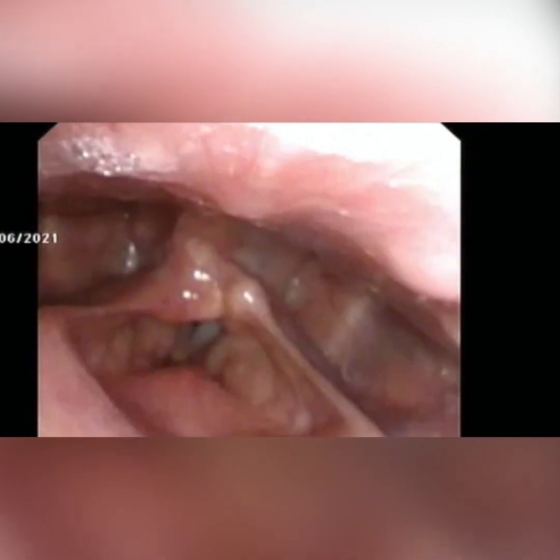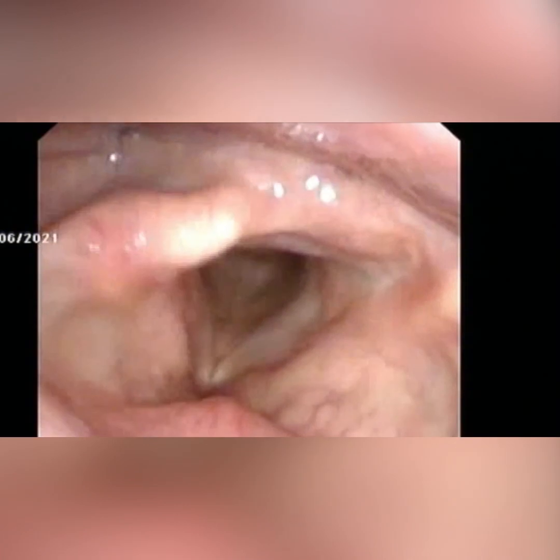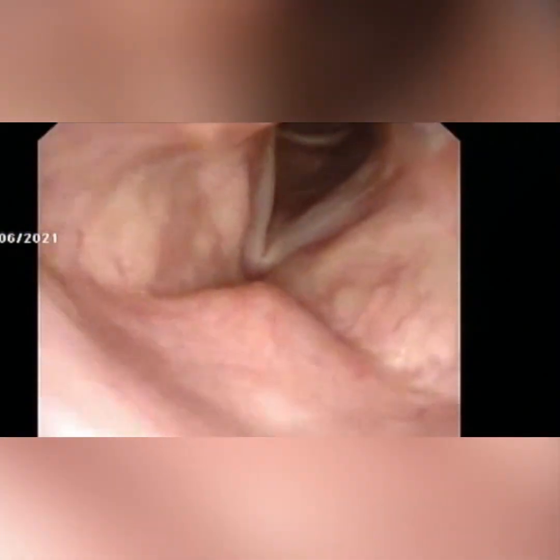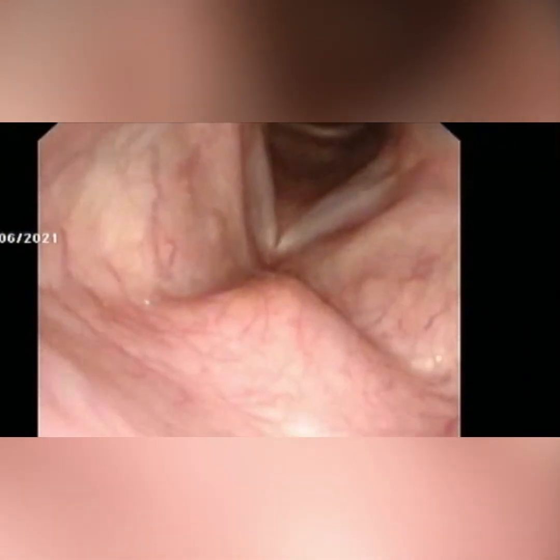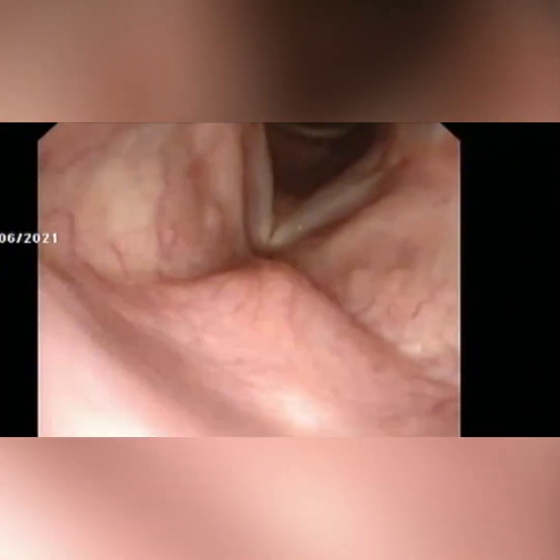This patient has a right mobile vocal fold and a left paretic vocal fold. We are going to perform a percutaneous trans-thyroid injection laryngoplasty. The first thing we do is apply external pressure on the cricothyroid membrane and view its movement with the endoscopic view, which gives us an idea of where to insert the needle.